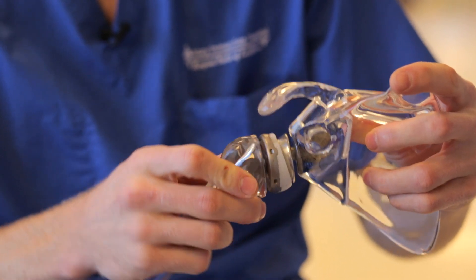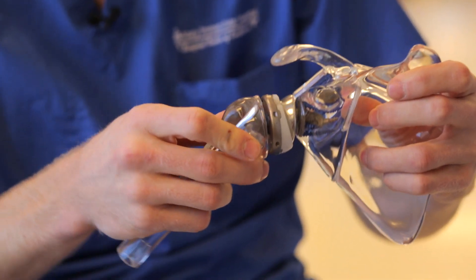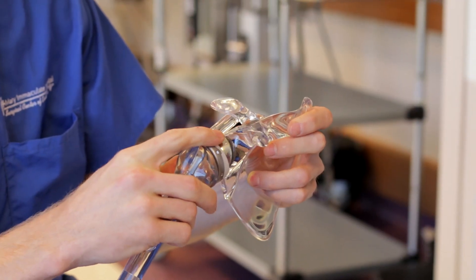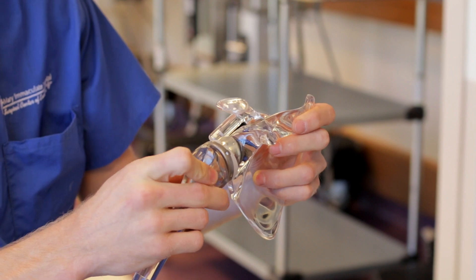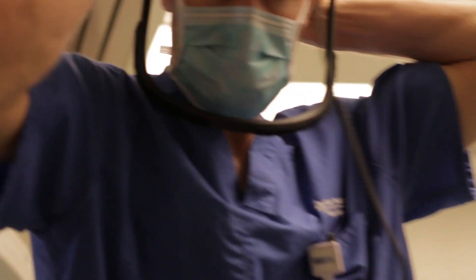This is a more stable configuration that enables the deltoid muscle to perform the function that the rotator cuff, which is torn, once did. A candidate for reverse shoulder replacement is someone who has arthritis and a tear of the rotator cuff tendons, significant bone loss around the shoulder, or has had a failed shoulder replacement.